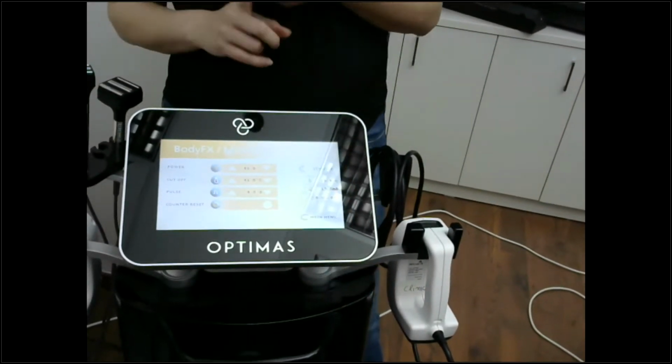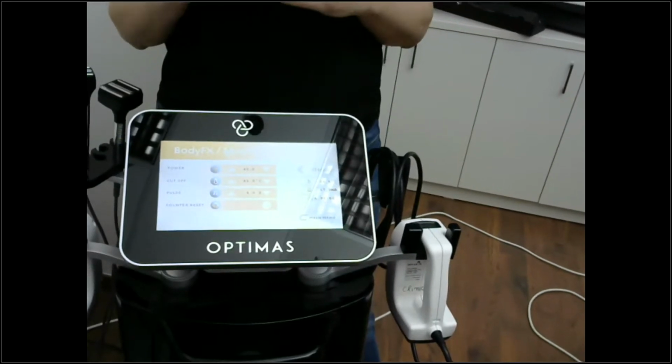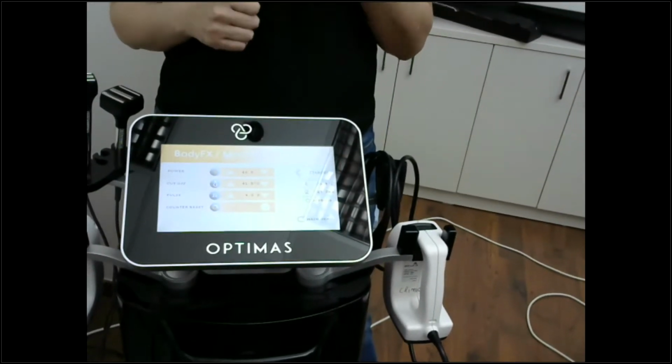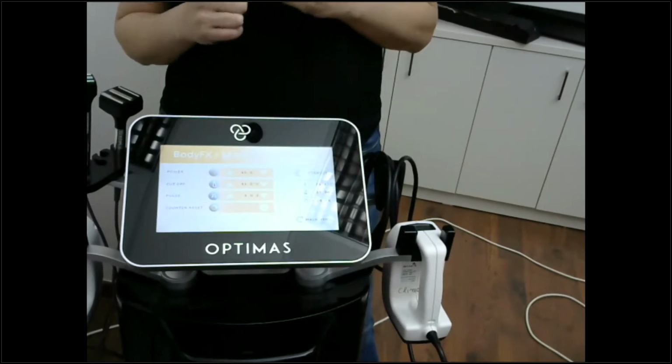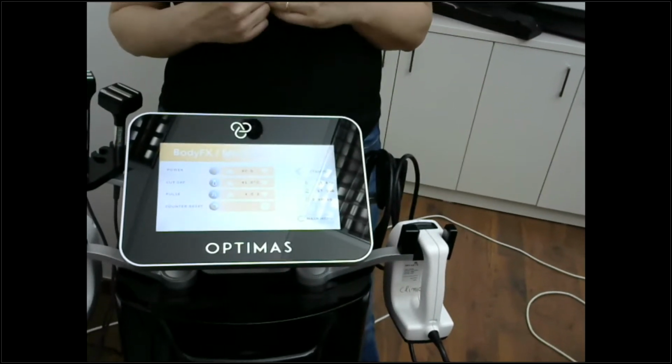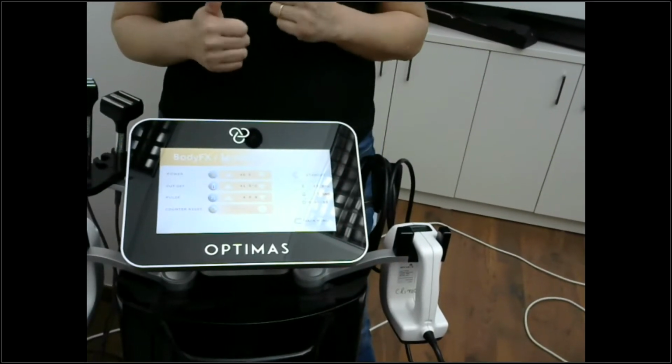So if you don't get good enough contact, you have the sound indicating that. At the phase of rising temperature, you have 1 beep per second, then 2 Celsius degrees below the cutoff temperature, you get 2 beeps per second, and then at the cutoff temperature, 3 full beeps per second.